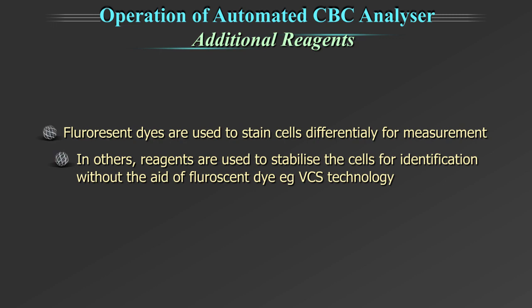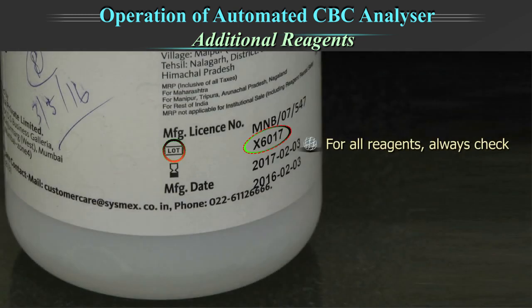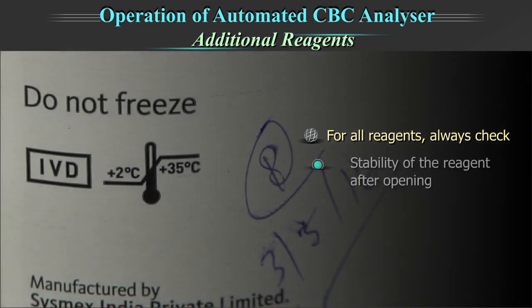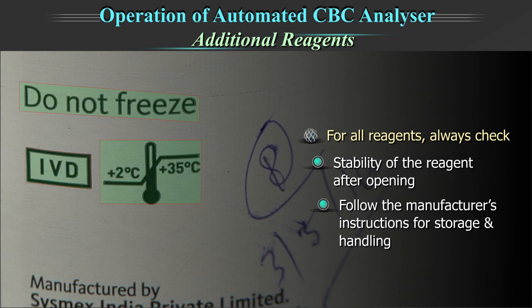conductivity scatter technology. For all reagents, always check the lot number and expiry at the time of receiving and before opening the reagent. Note the stability of the reagent after opening and follow the manufacturer's instruction for storage and handling.